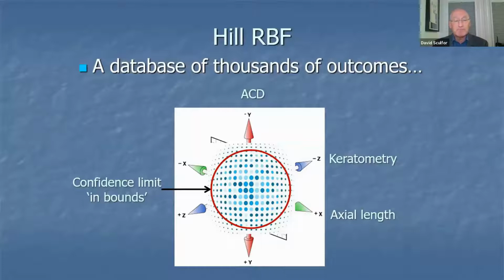And that's why Warren Hill could quite justifiably say to his patient, you have got a 90% chance of not needing glasses for distance afterwards. But statistically, can't argue with that. As I say, the difficulty is every patient hopes they aren't one of the 10%. But sadly, somebody has to be. But it works. It's a really good formula, and it does seem to me to be the way that things are going now. It is big data.